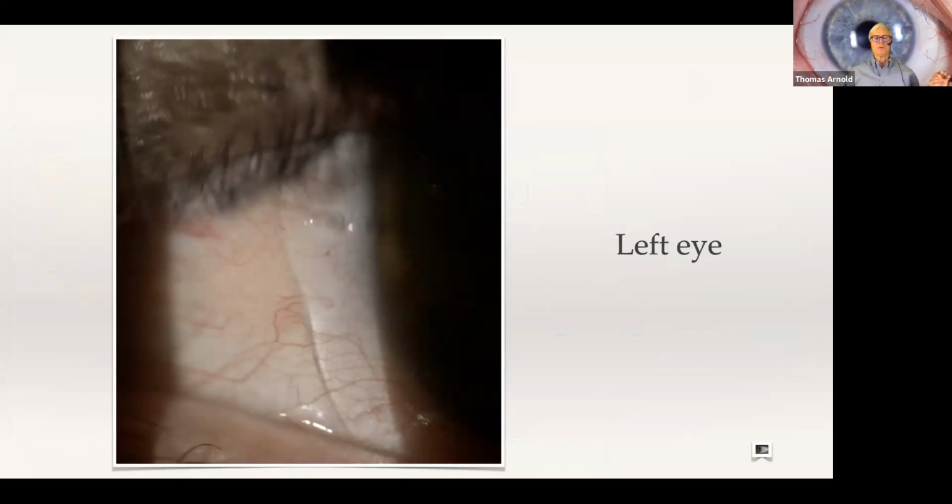The difference between this and a notch is this is a uniform thickness all around the edge. This is just like taking the edge and bending it over this, if you will. We're not cutting into the body of the lens. This edge is not thicker anywhere along. It's just retreated, as you see. We made it 3 millimeters wide and 0.3 millimeters deep. We've pulled it back, but the edge configuration is uniform all the way around the lens.